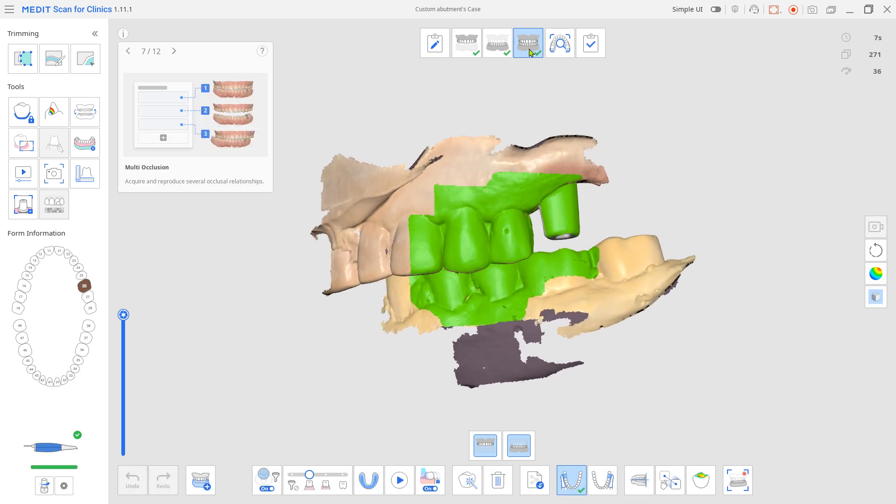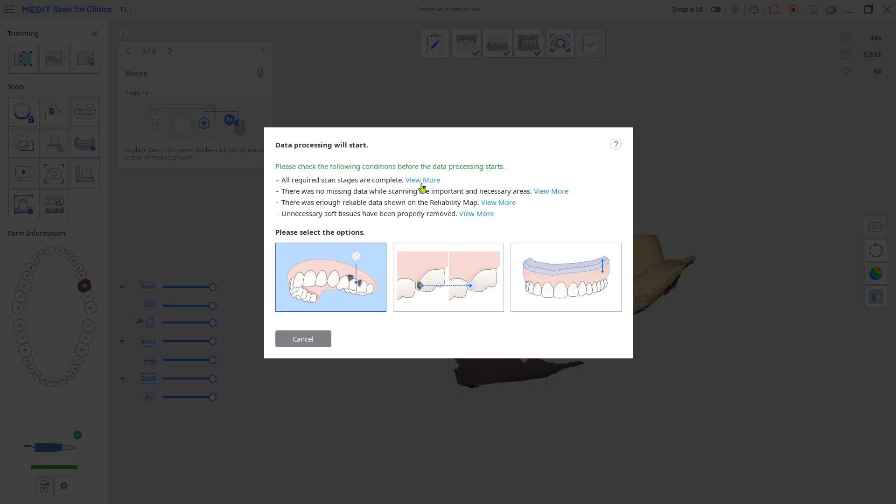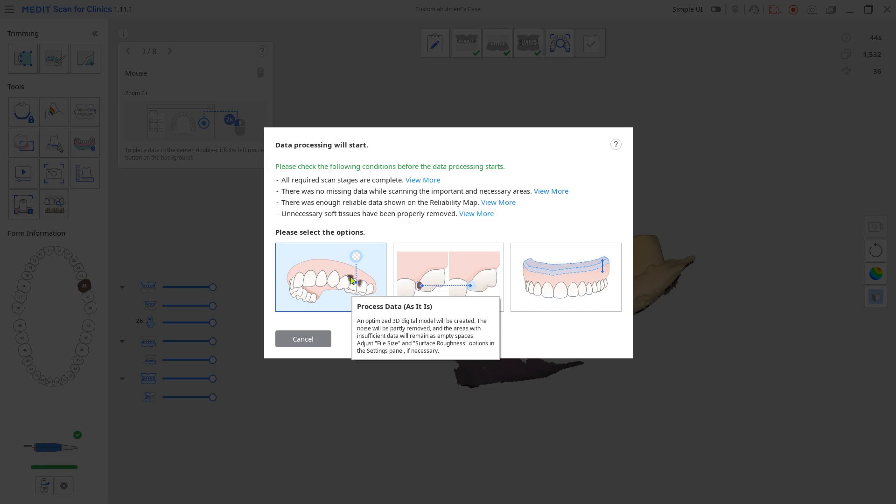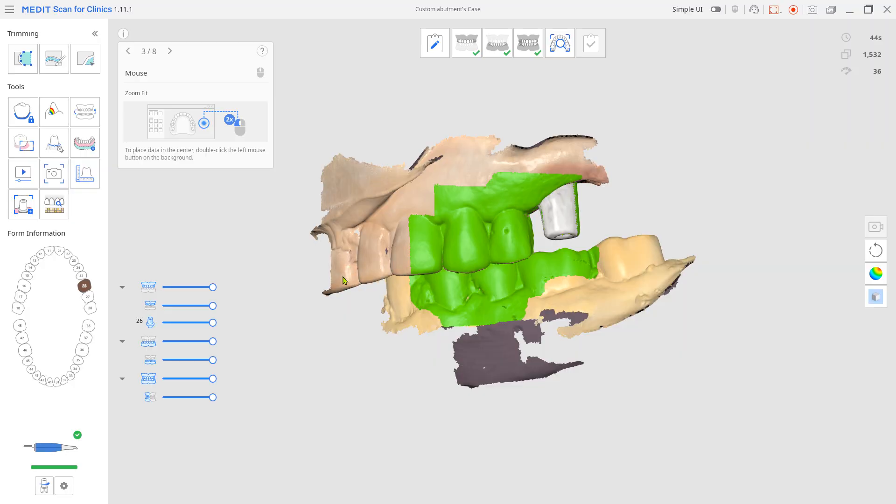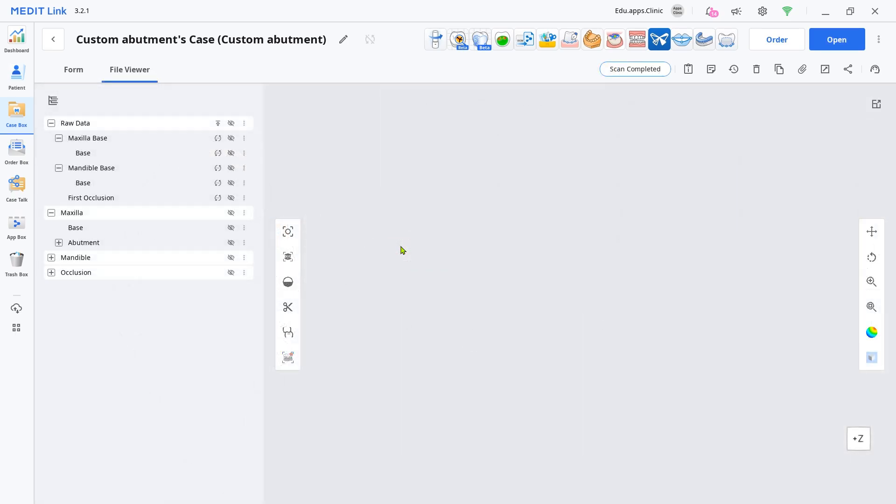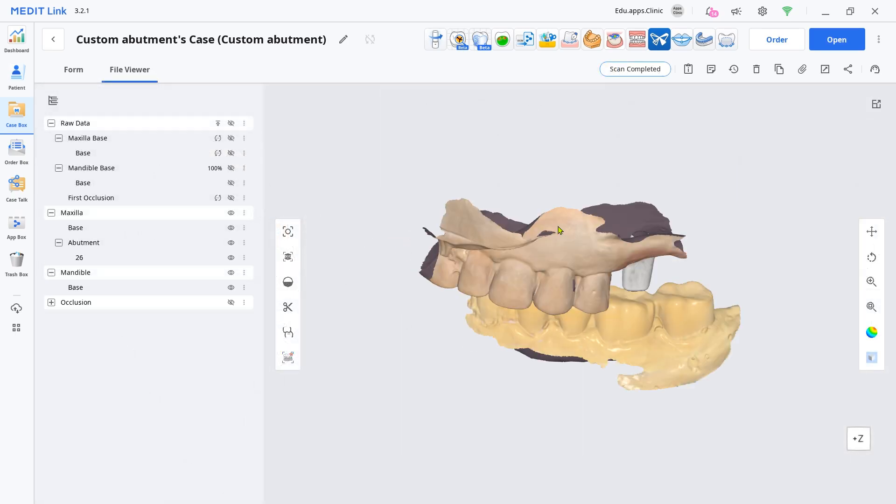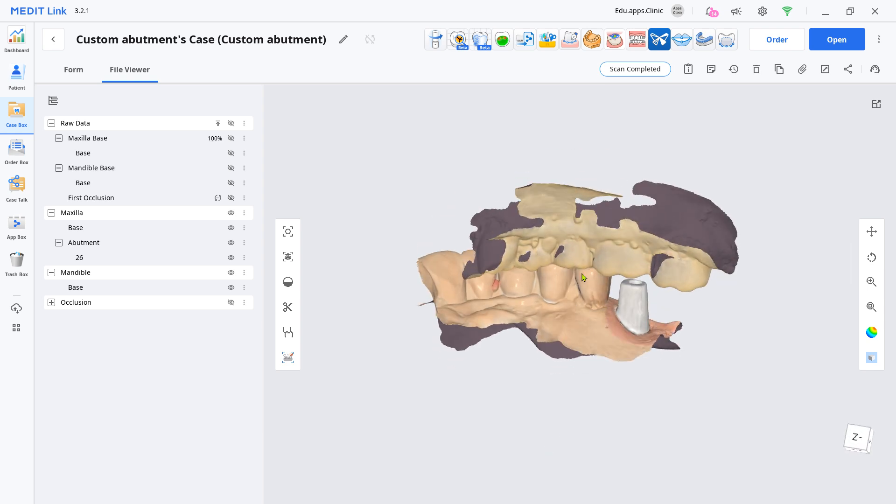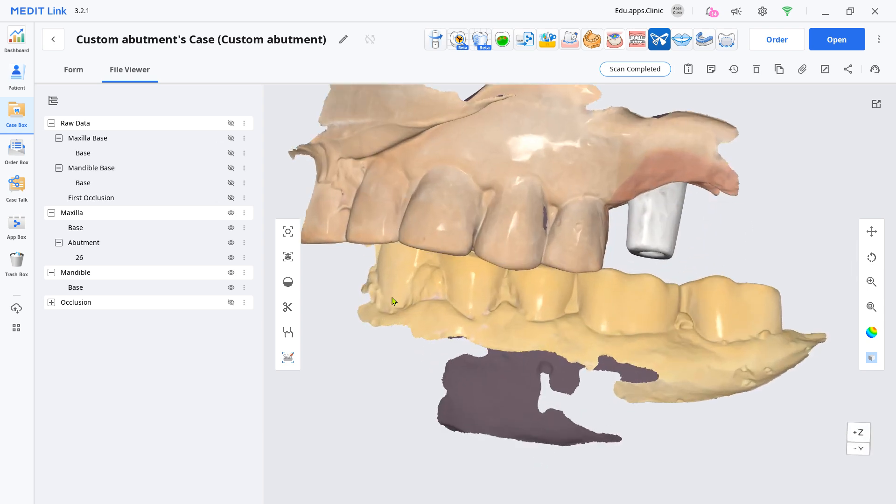Click Complete to save. Choose as is. Go to the File Viewer tab and export it to send to your lab.